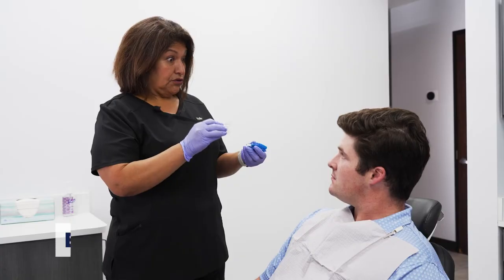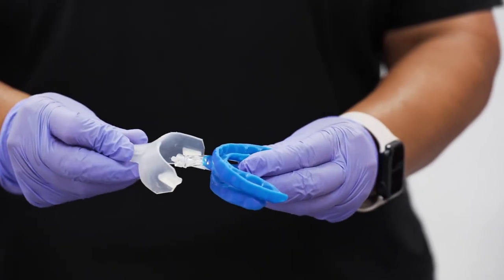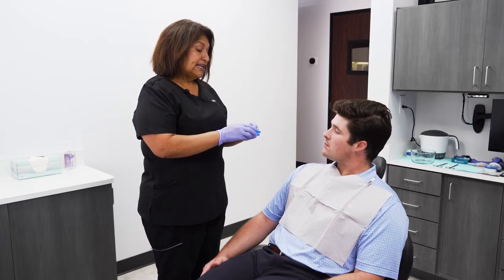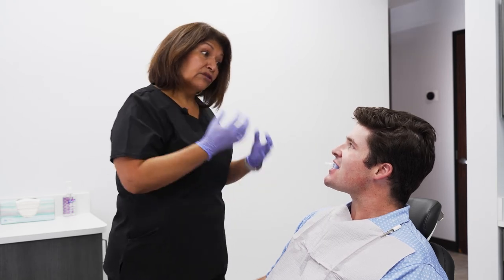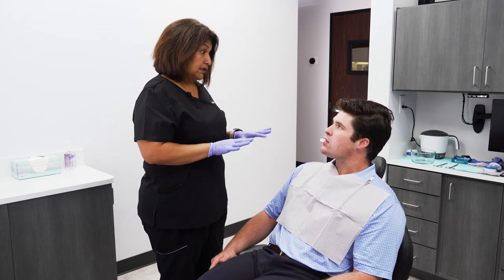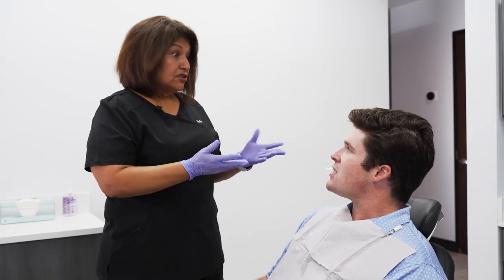Now that we have your FlexTap fitted to your teeth, we're going to show you how the mouth shield works. Every kit will come with one. Basically what you're going to do is place the shield over the post and slide it on there, then take it and place it over your teeth, and the shield actually gets tucked in between the cheeks — that's going to create a good seal for any air. The shield is going to force you to breathe a little deeper through your nose, which is going to get you more oxygen in. It's going to help the heart rate be calmer, help you feel better, and keep you from having a dry mouth, making it more comfortable.